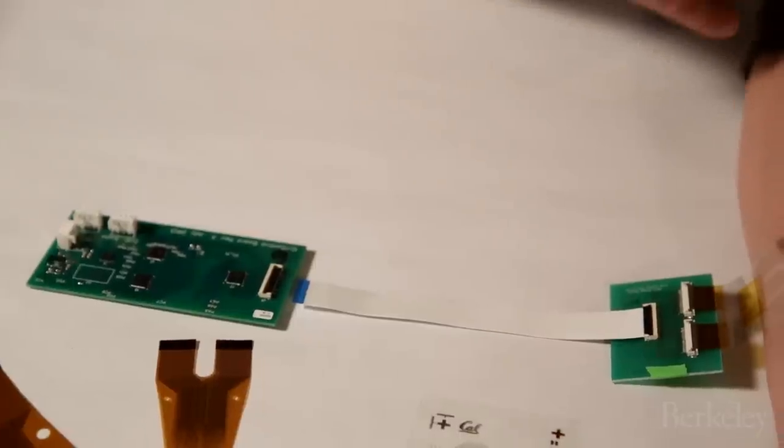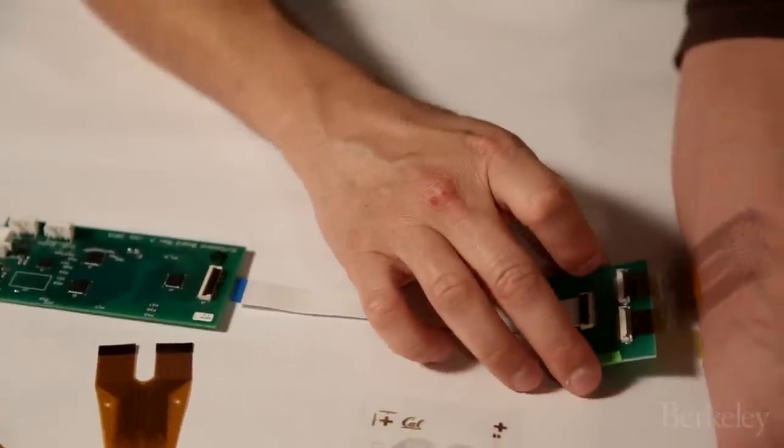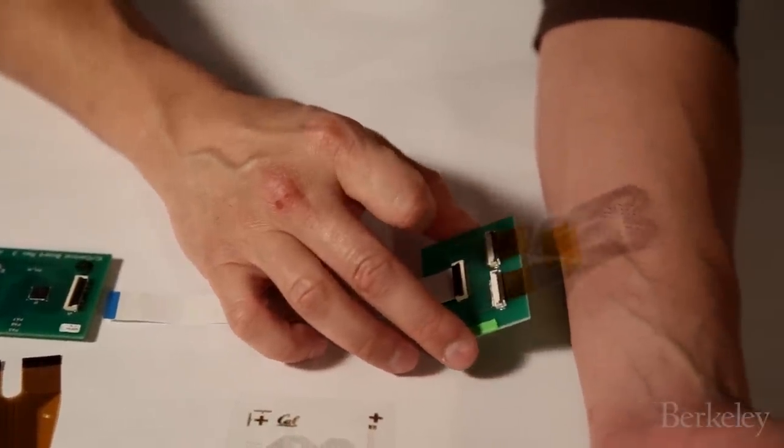All of this can be miniaturized into something that would fit into a pen thermometer, very small, something could be carried around by a nurse or worked into the wound dressing itself.